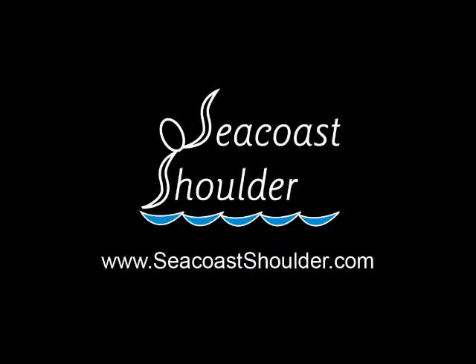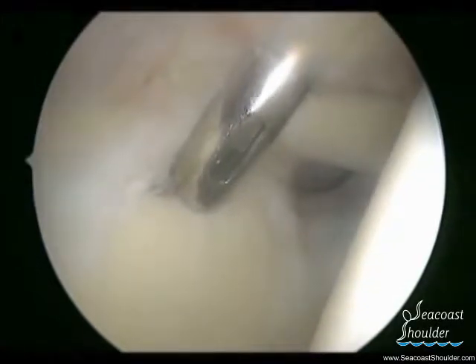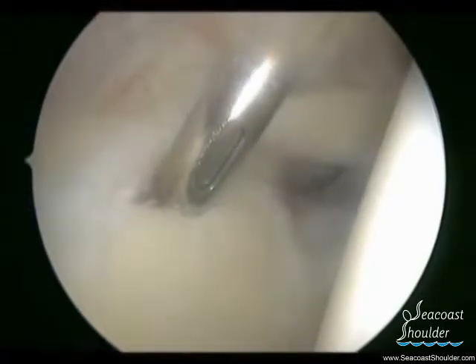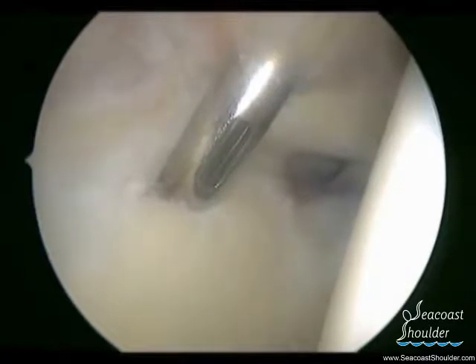This is a video of a patient who has a superior labral tear, also known as a SLAP tear. In this right shoulder, the humeral head is to the right, the glenoid is to the left, and the superior labrum is on the top of the glenoid.